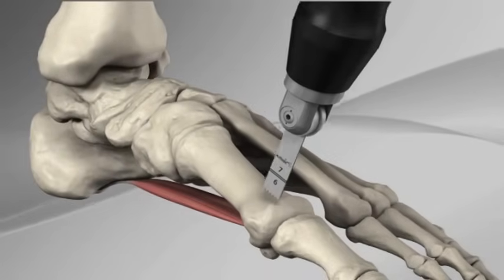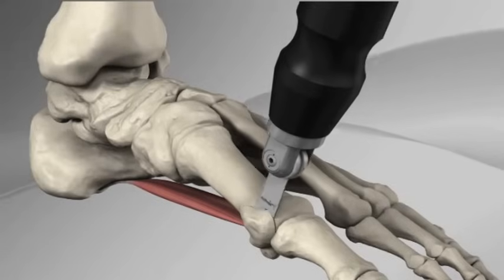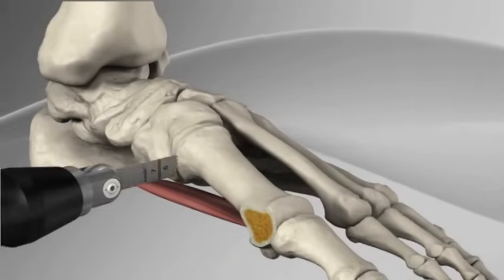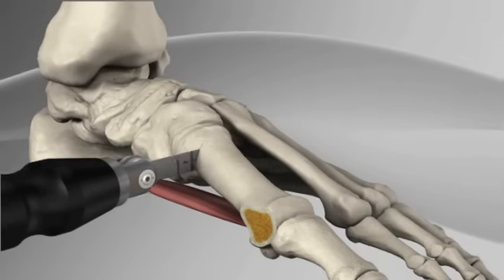A saw blade is used to remove the prominent bump on the inside of the big toe. The saw is then used to make an oblique cut in the base of the first metatarsal.